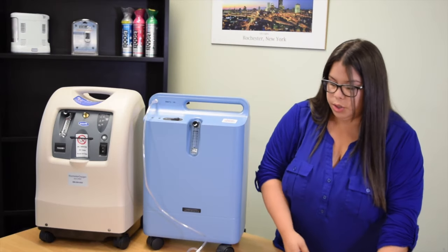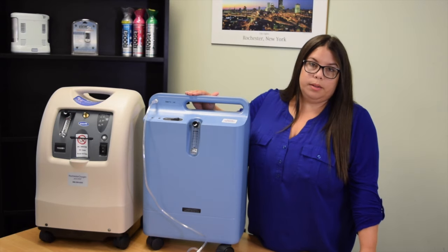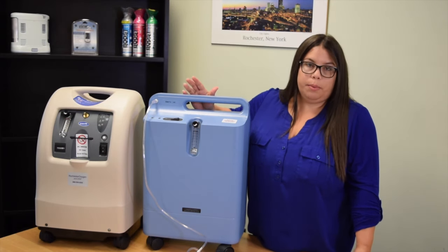Next we're going to turn on our concentrator. You will hear some audible alarms, which indicates that the concentrator is working properly.